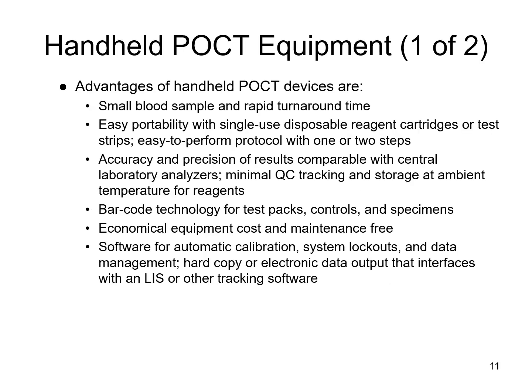Your handheld point of care testing devices would include something like glucose meters, the iStat meter that I mentioned earlier. There are things like A1C meters that test for the presence of blood glucose over a length of time, a 3-month period. With these point of care analyzers, most of them do have some sort of built-in QC within the machine, especially like your blood glucose machines that most people have at home. It goes through checks every time that you turn it on.